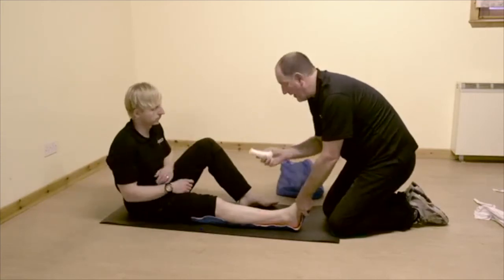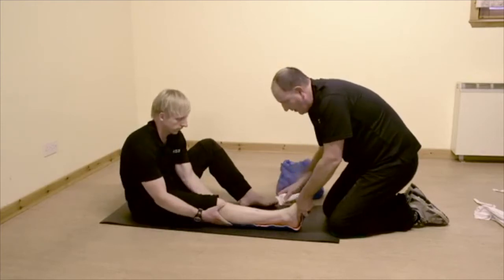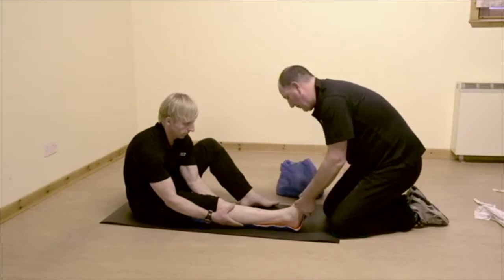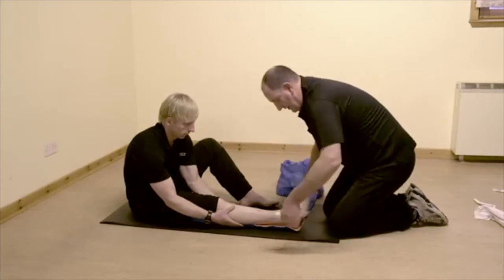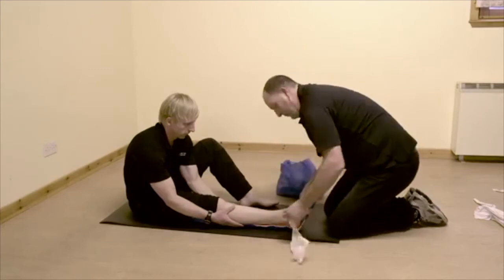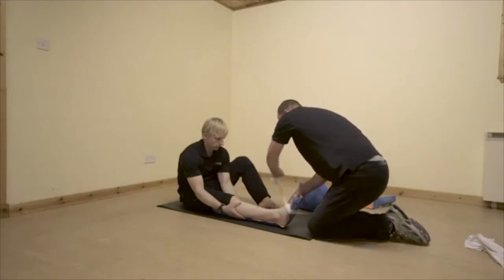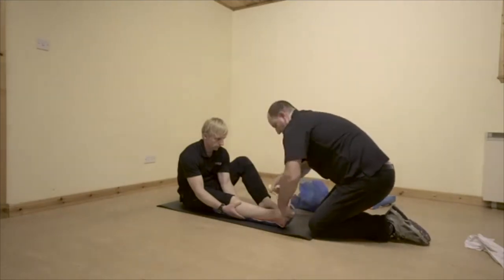So I have got some bandages here, so I'm going to start rolling these. I'm just going to hold this bandage here and start wrapping it around your foot. I'm going to make it nice and firm and tight to make sure nothing's going to move. I'm going to wrap this around and try to keep the bandage as broad as we can as we're doing this, and just keep it nice and tight.